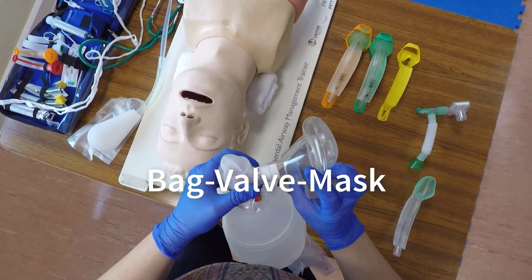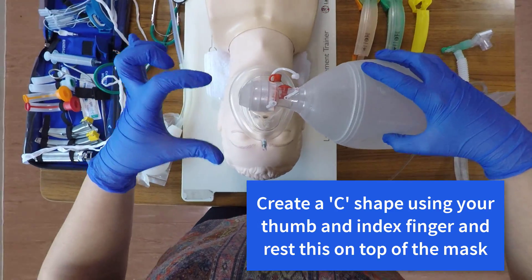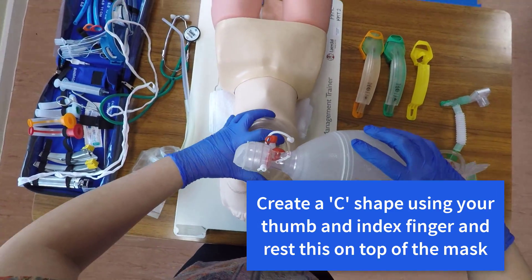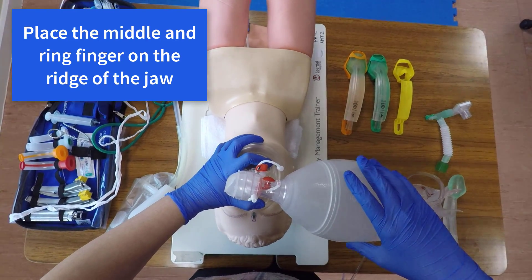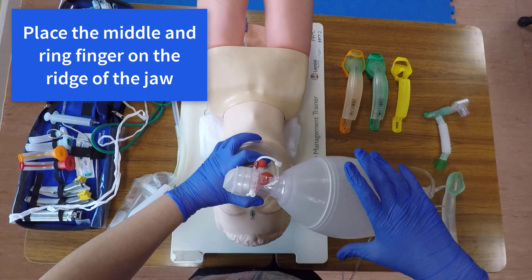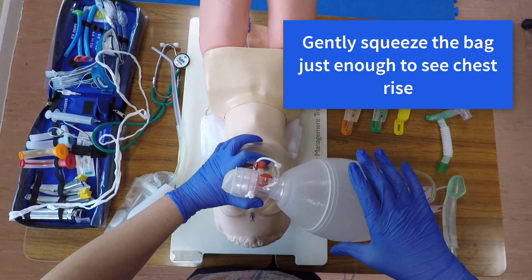To perform single-person ventilations using a BVM, first select the correct mask size — it should extend from the bridge of the nose to the chin. Use a C shape with your thumb and index finger and rest this on top of the mask. Place the middle and ring finger on the ridge of the jaw. Gently squeeze the bag just enough to see chest rise.